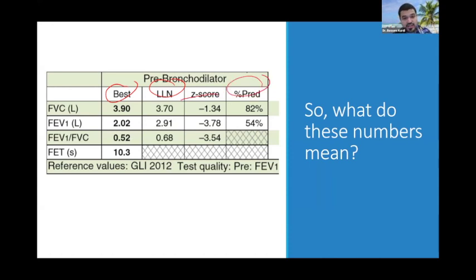If you're not a pulmonologist, or a respiratory therapist, or somebody who is interested in that, the ratio and percent predicted is really what you need to know. What is a normal percent predicted, or a normal ratio, is a big debate. Let's start with the FEV1 FVC ratio. What is a normal FEV1 FVC ratio? In kids, it's either 85 or 80. I go with 80, and that's what most places will do. But you'll see sometimes in different documents, 85% or 0.85 used. So stick with 80%.